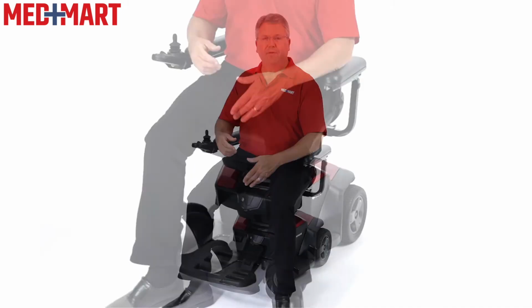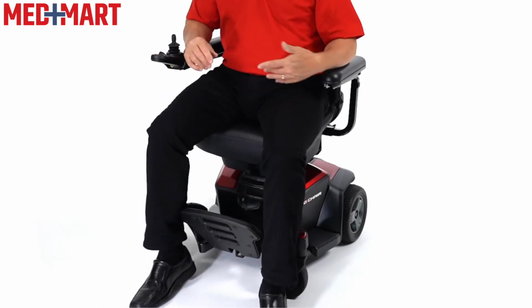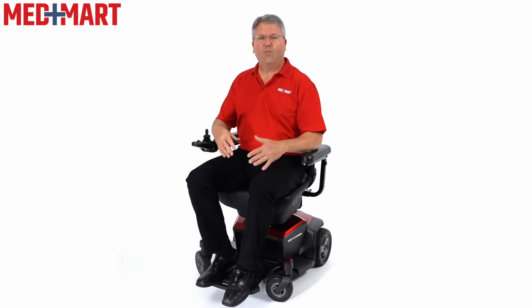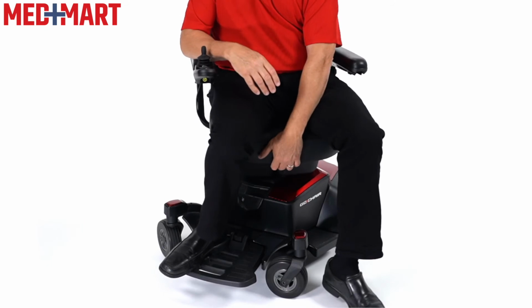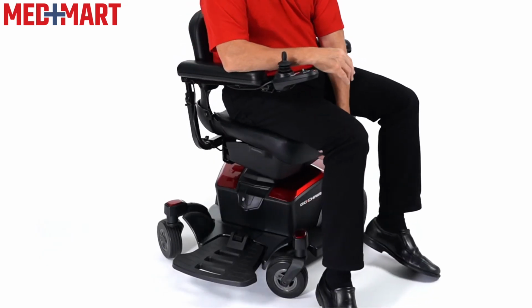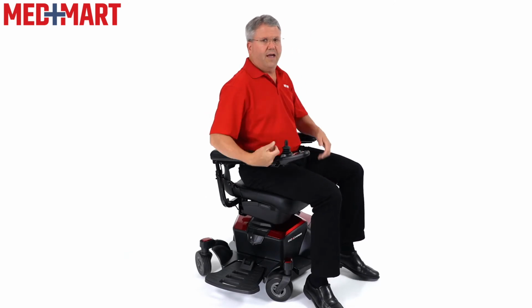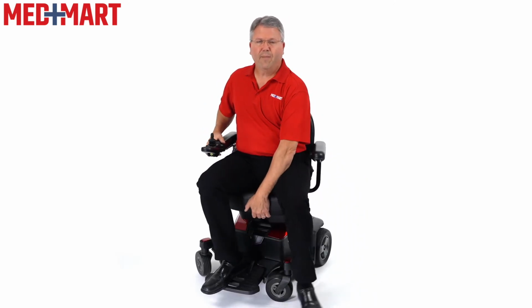So a couple things make it a little bit easier to get on and off the power chair. One is the ability to fold up the footrest, because obviously once that's up, it makes it easier to step forward off the chair. If you have any difficulty with that, one of the features you can use is a little lever in the front, so I can turn the chair. First, it locks in at a 45-degree angle, then I will take it all the way around to 90 degrees. If that makes it easier to get on and off the chair, I can simply step up from here, and then when I'm ready to get back on the chair, I sit down, swing my legs back around, and put them up on the footrest.